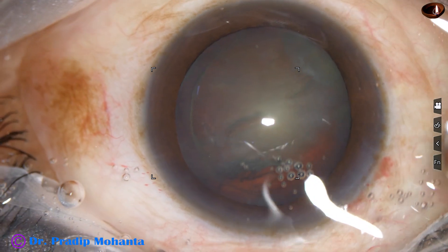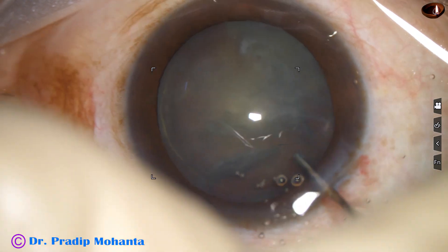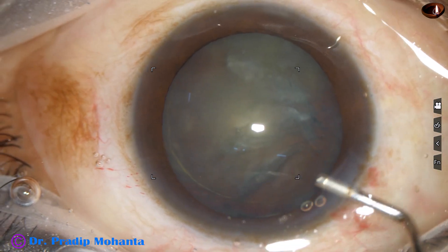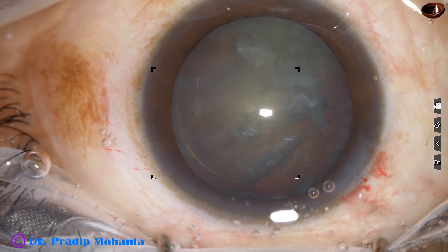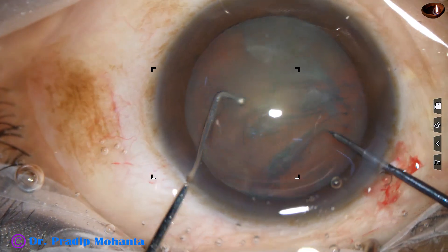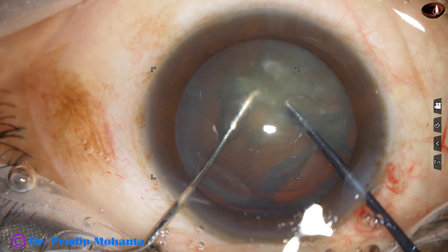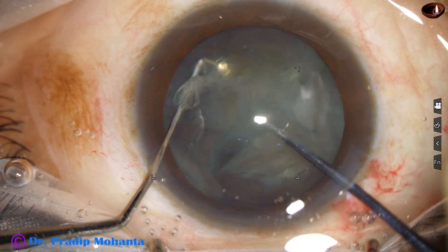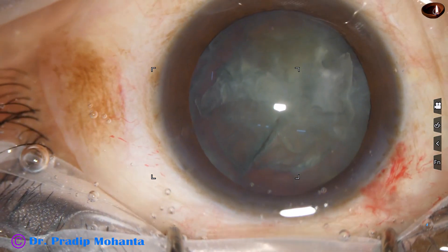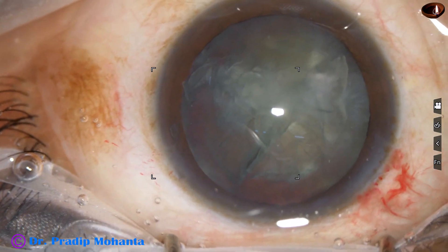Hydrodissection is done and hydrodelineation is attempted with BSS and a 27-gauge cannula. The nucleus rotates. The anterior chamber is again filled up with Visco, and now is the time to divide the nucleus into some fragments. I am using this pre-chopper for dividing the nucleus into three pieces. This pre-chopper has been designed by Dr. Sohail Irfan Khan from Nandid, Maharashtra, India.